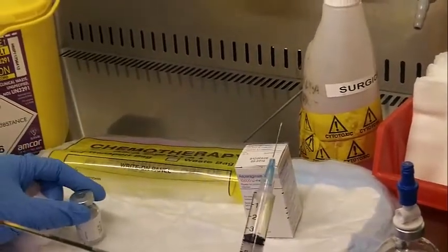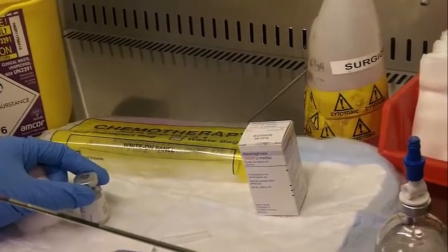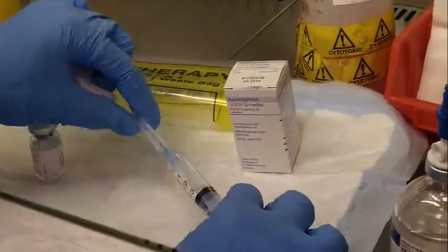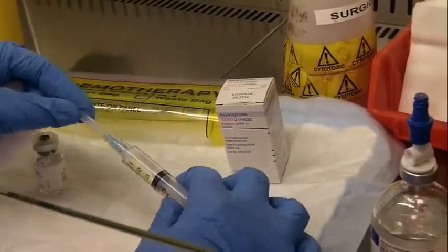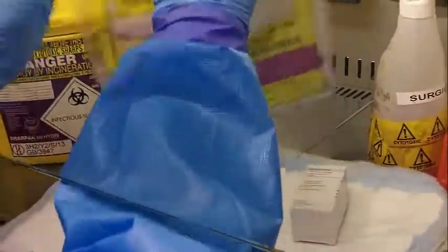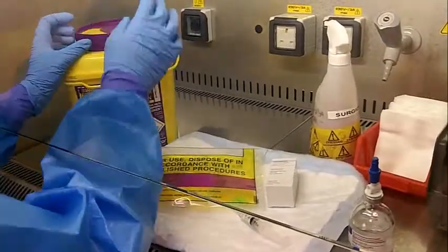Ideally, you don't want to recap your needle and syringe, but I'm not going to inject the dog straight away. So when you do recap, always slide it in on the tray. Don't use your fingers, just scoop it up on the tray and then push that on. This will be contaminated, so that will go into the soft waste. And this is classed as sharps, so it'll go into the sharps bucket.